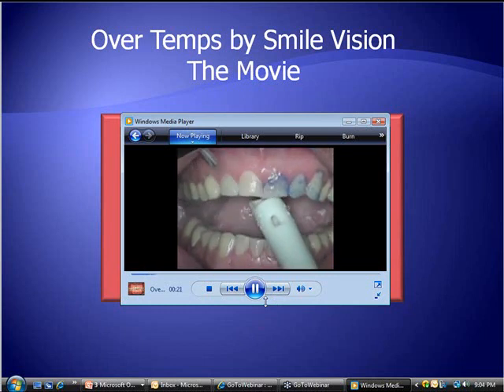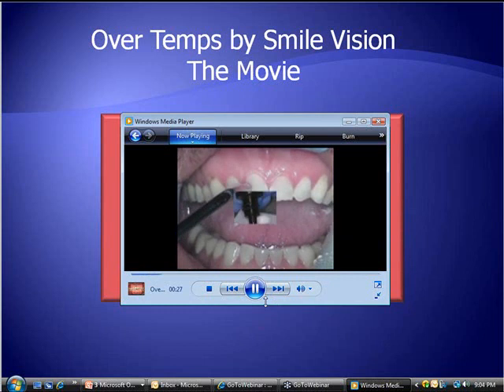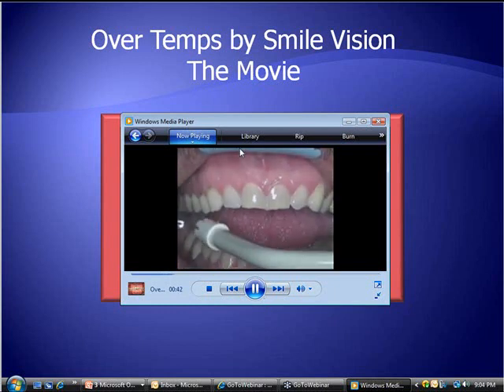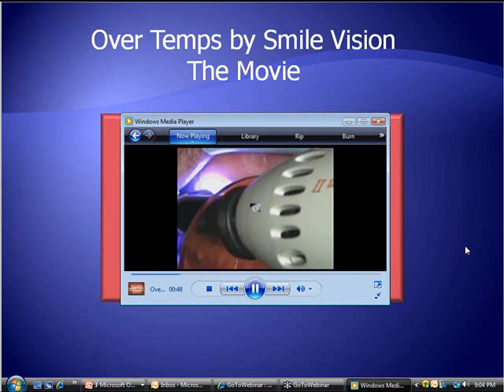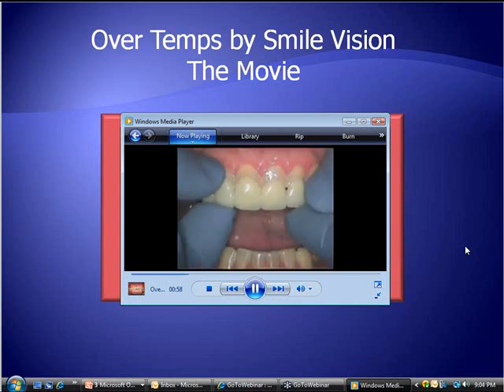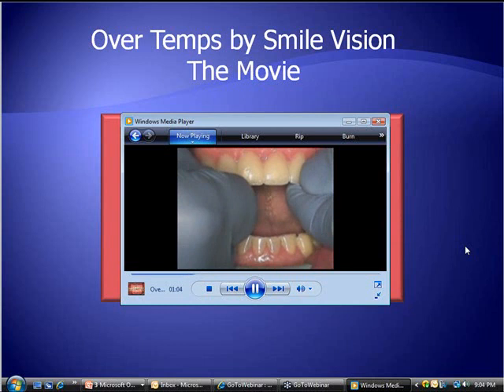Here the teeth have been etched 10 to 15 seconds — and FYI, no labial preparation had been done on these teeth. None. The OverTemps can be brought down to three-tenths of a millimeter so that the teeth don't become bulky. I'm using Premier Comfort View to keep the soft tissue out of the way. Place the bonding agent on, air dried. I like Calibra — that dense dual-cure paste — because it's very thin, it flows nicely, and I can seat these very easily. That's Caulk's Calibra, not a bonding agent but rather a luting agent.